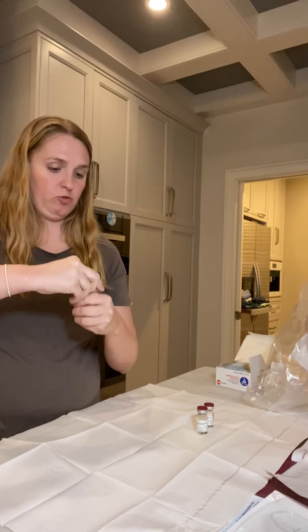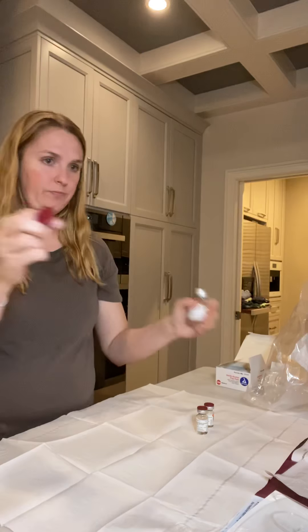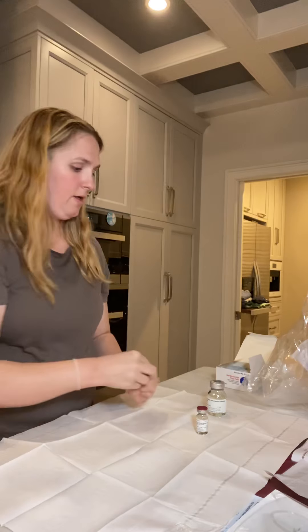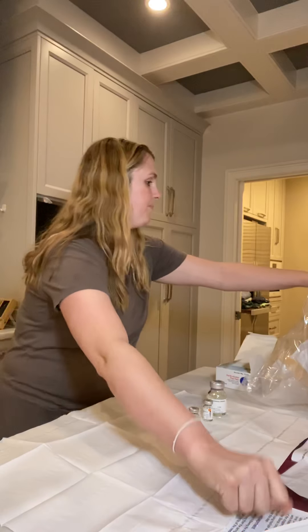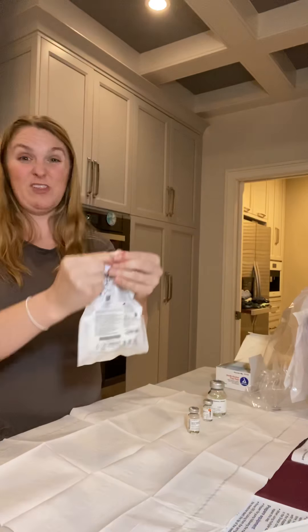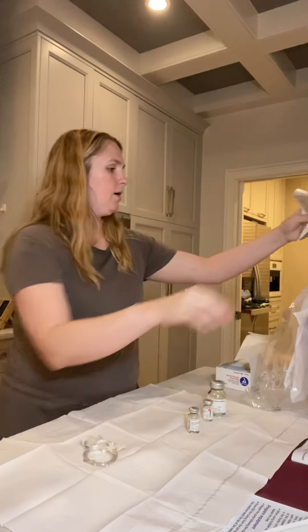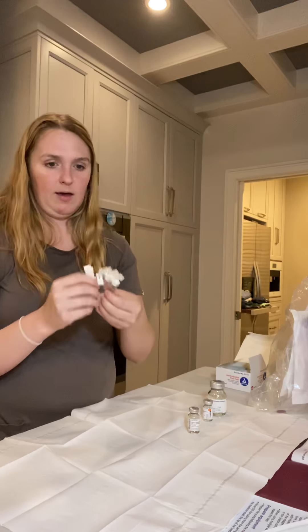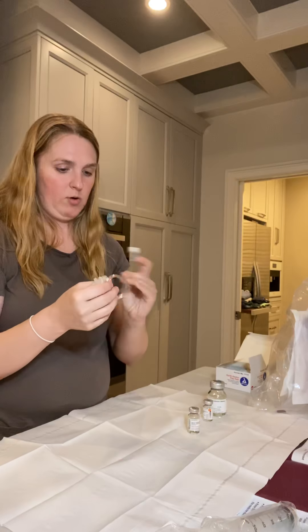The first thing I do is pop the lids off of the canisters of medicine. I'll alcohol wipe the tops before I take the liquid out, but not yet. Then I'll open the tubing. This is what takes the liquid — gel is really a better word — from my big giant syringes that I'm about to open, into the needles that go into my stomach.